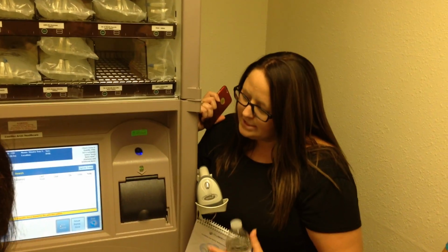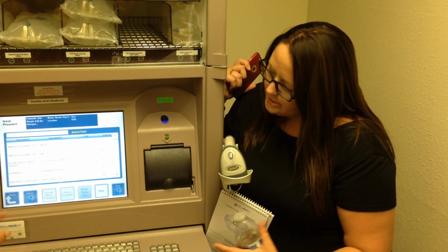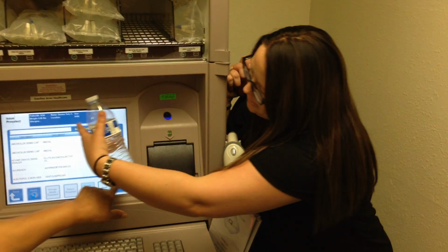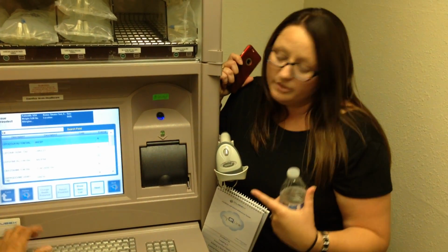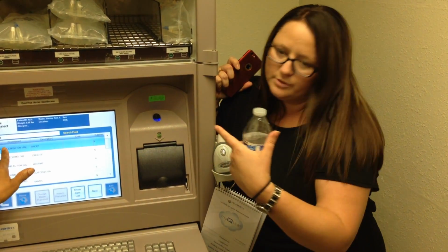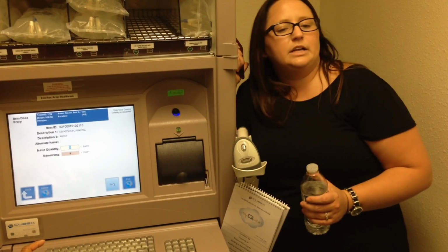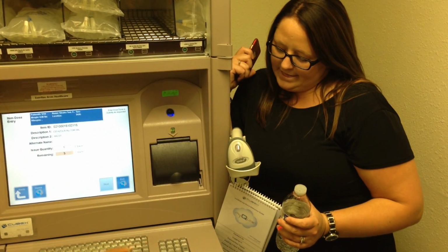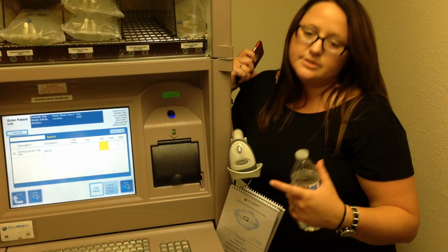We're going to grab out some cefazolin once the entire list loads. It's going to take a second. This is the first time it's loading since it's started up. You can actually use the search box right there. As you type here, it will narrow. So C-E-F, oh, it's right there. Yep, that's perfect. Once it's blue, it's selected. You can hit next. Declare how many you want, which will be 1. And then hit next. So this will start to build a list.